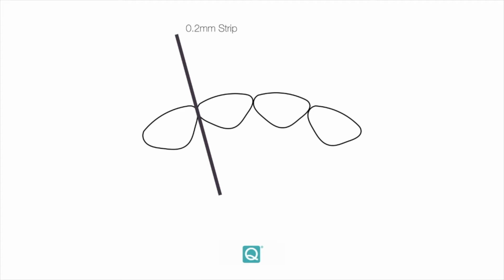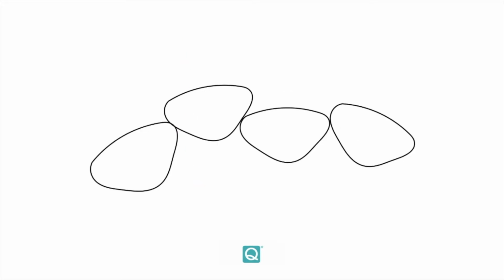However, it's not always this simple. This is a diagram of a typical scenario. Your patients come in without straight teeth quite often. So here, if we were to use the same technique and use an IPR strip, then it would go in between the teeth like this. And when you apply the pressure, the forward-back pressure, you would end up getting IPR in these areas. Now, the problem is, this is not where the IPR has been prescribed, and although when you're moving it to and fro, you will get that 0.2 millimeters of separation, you're actually getting it in the wrong place.